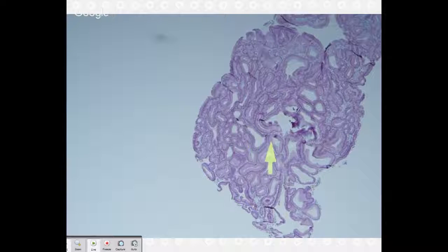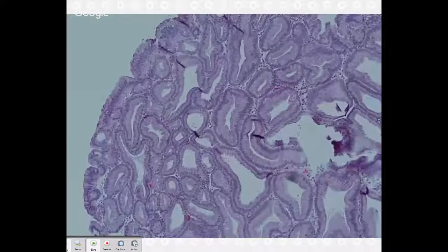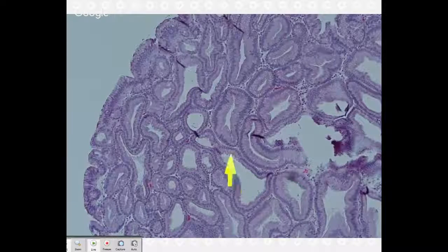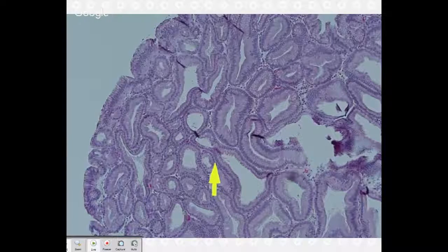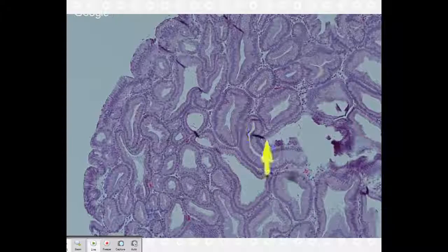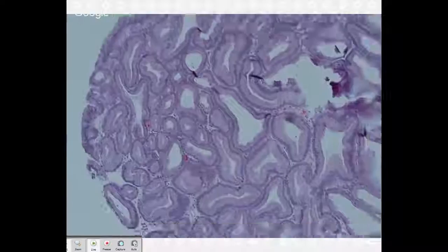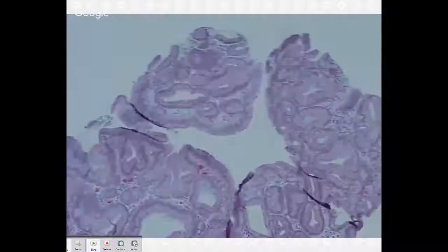The cells, for the most part, should be columnar cells with abundant amphophilic ground glass cytoplasm. The nuclei respect their basement membrane. They're usually small to slightly columnar looking, but not cigar-shaped like an adenoma, right? And the glands are back to back to back. And these show up in the stomach, in the gallbladder, in the intestines.